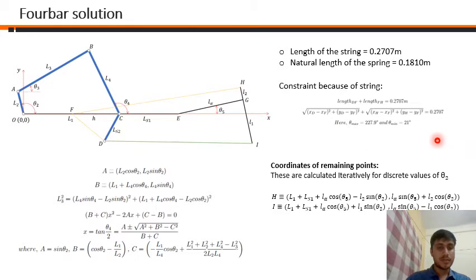Here, we have shown the schematic of the mechanism and the analytical solution for the same. With the equations, I solve the forward kinematics of the mechanism with link 2 as the input link. This is where the motor is attached. Then, after solving these equations, the natural length of the spring and the length of the string are known. Also, at the knee bending phase, the length of the string is constant, which is a constraint, and is used to solve the rest of the motion of the knee joint.